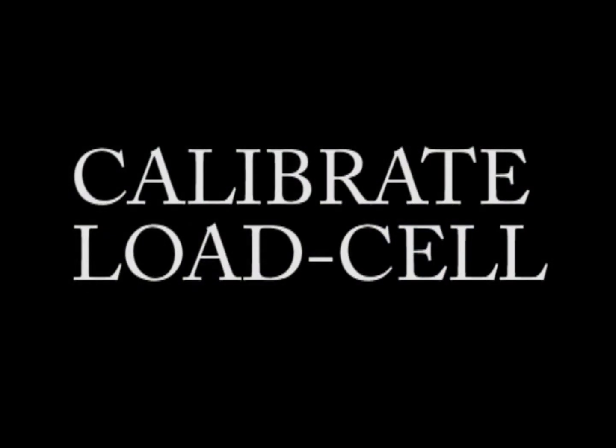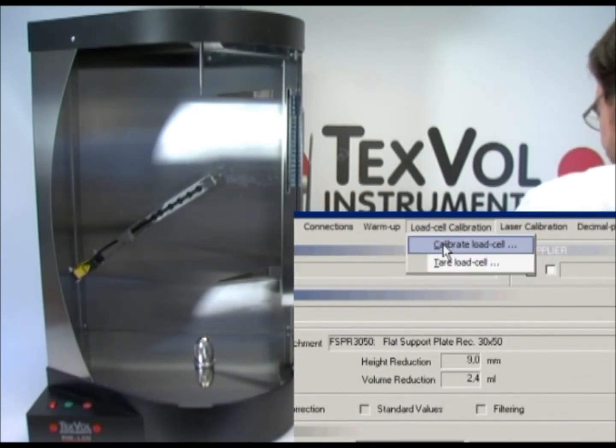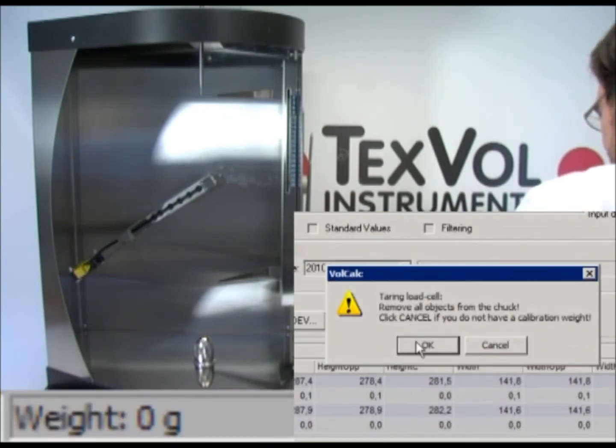If your instrument is equipped with a load cell, it needs to be calibrated from time to time. The frequency of this is up to the operator. It is advisable to set up a routine for the frequency. Click on Load Cell Calibration on the toolbar.